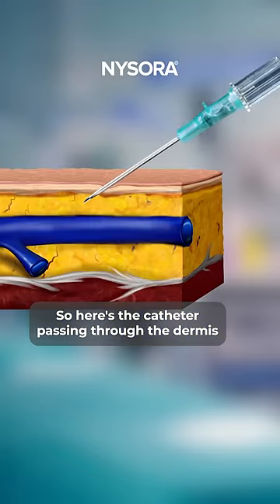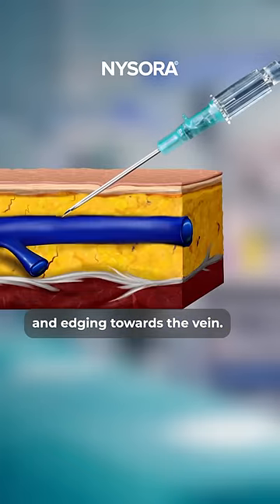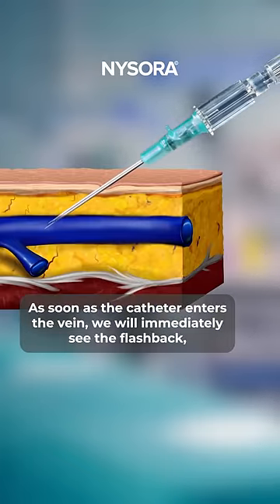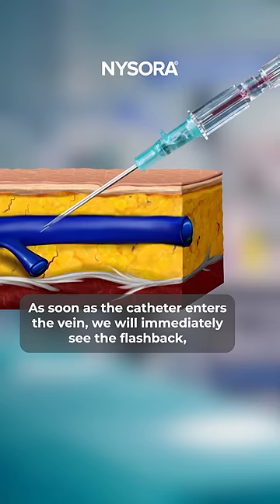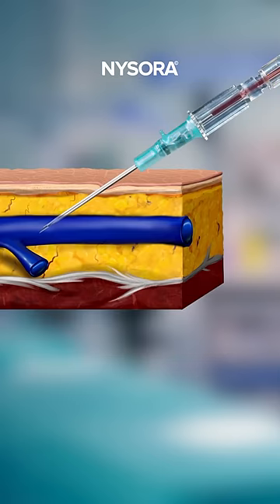Here's the catheter passing through the dermis and edging towards the vein. As soon as the catheter enters the vein, we will immediately see the flashback — as we call it — because the blood will want to go into the expansion chamber.